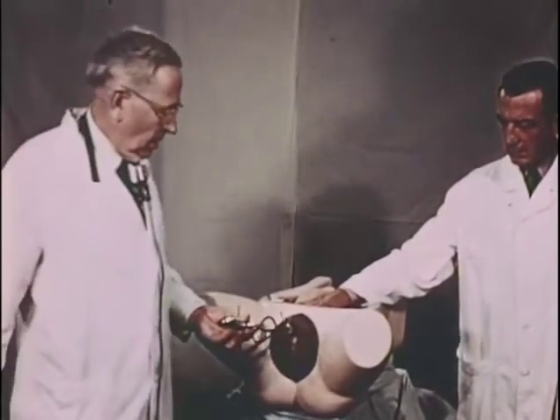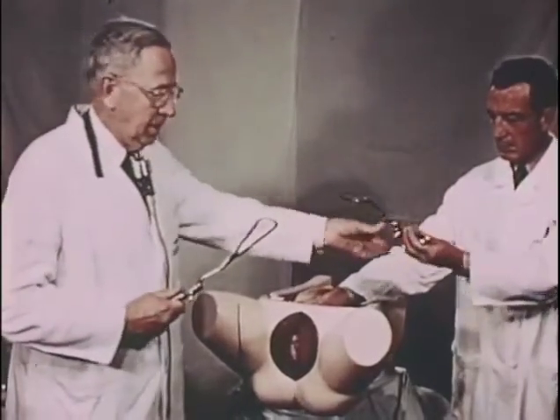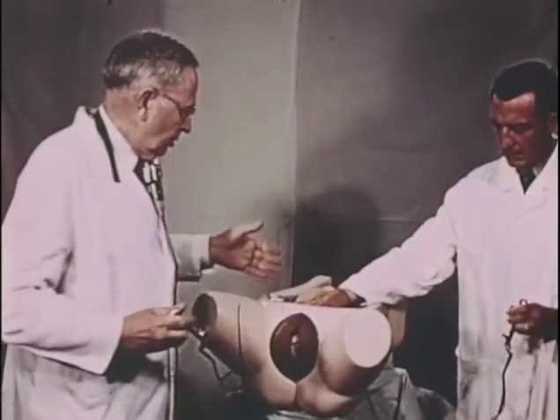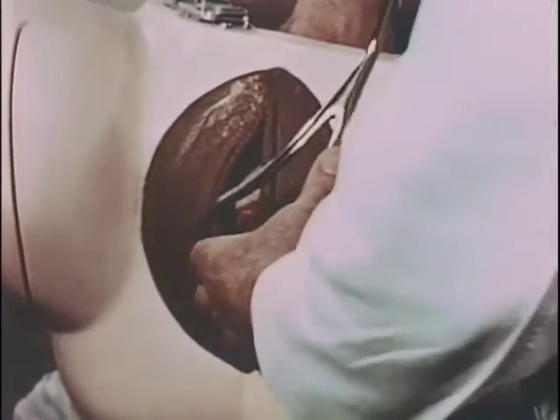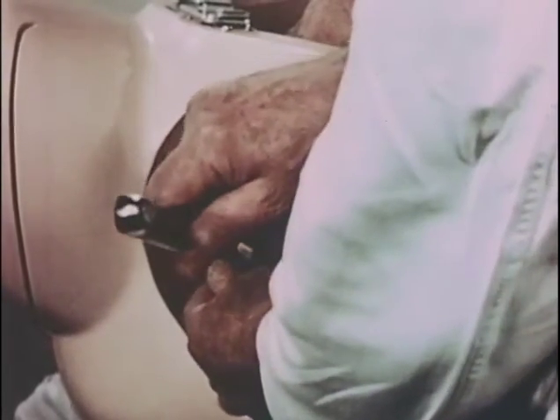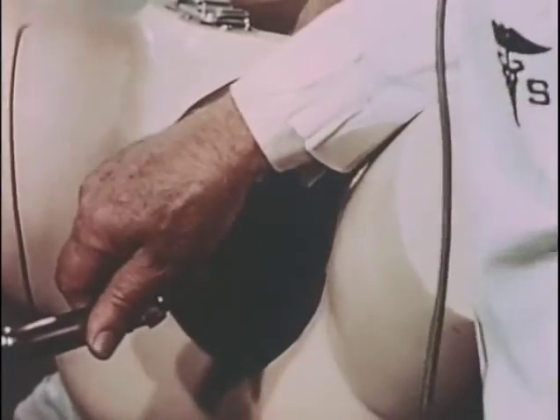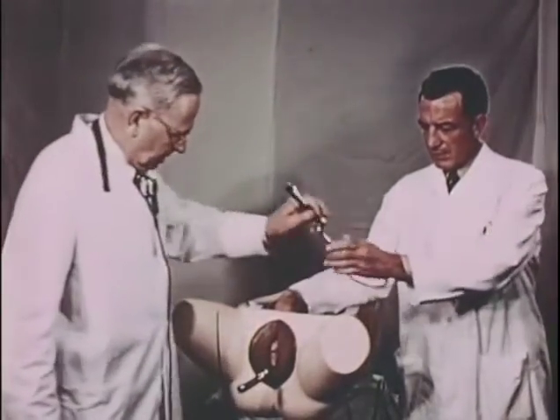Posterior blade technique. Posterior blade is put on first. And it's the right blade held in the right hand, inserted to the right side opposite the right posterior ear. The operator stands with his back in the hollow of the patient's left knee. The tips of the index and middle finger guide the toe of the blade posteriorly over the perineum opposite the posterior right parietal bone. The handle is carried downward and around over to the patient's right side in the position as demonstrated prior to application.